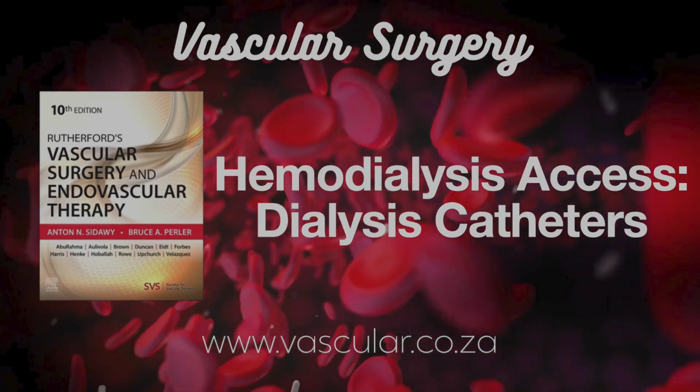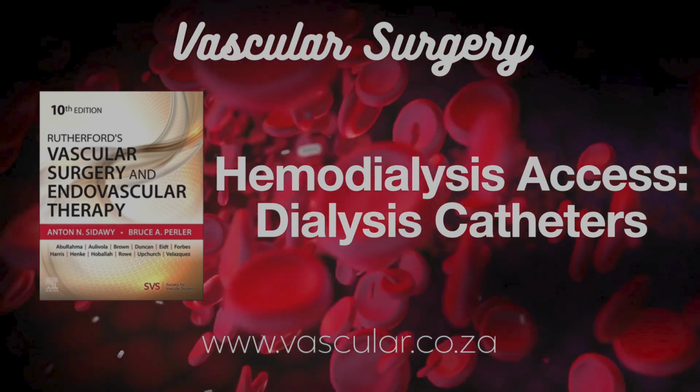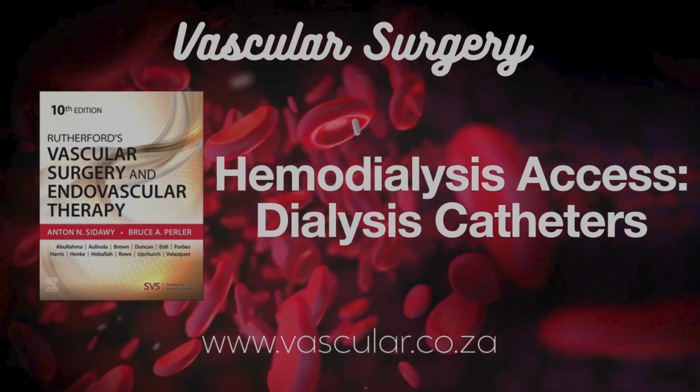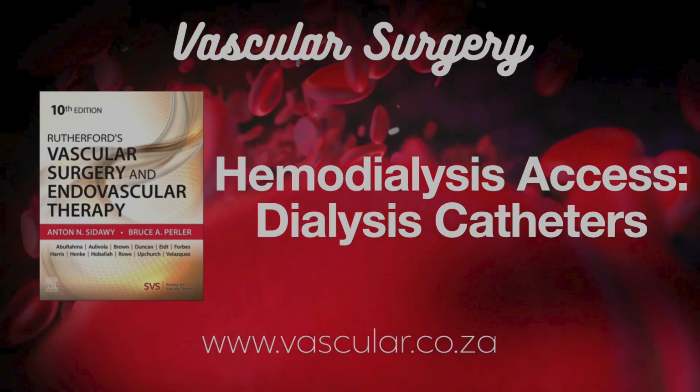Lastly, what if the catheter just ends up in the wrong place? Misplacement. Yeah, it happens maybe 3% or so in some studies, tip in the wrong vein or even the ventricle. Fluoroscopy should prevent this. If unsure, inject contrast to check.